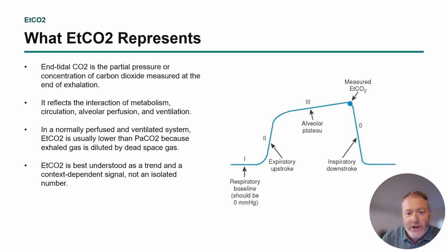So the waveform, I'm not sure if you guys can see my cursor as I move it. I guess I'll have to play back the video to find out. Hopefully you can, but if not, know that I'm tracing the line with the cursor now. So at baseline, in between breaths, your end tidal monitor should be 0.